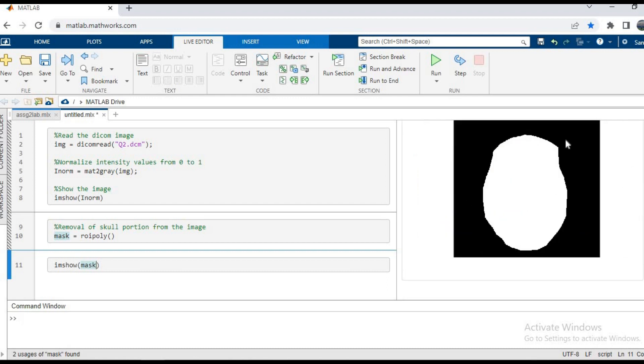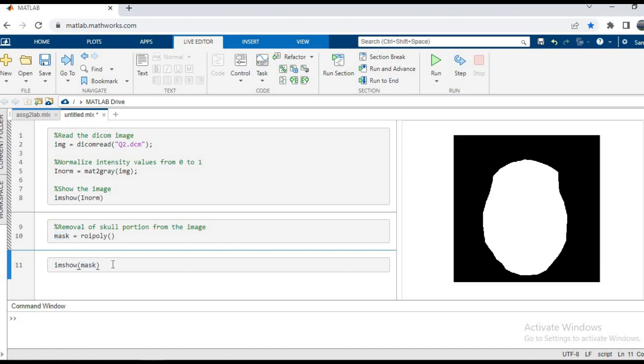As you can see, this is the mask in which the black areas are 0 and the white areas are 1, and we're going to use this mask to remove the skull and extract the brain tissue.